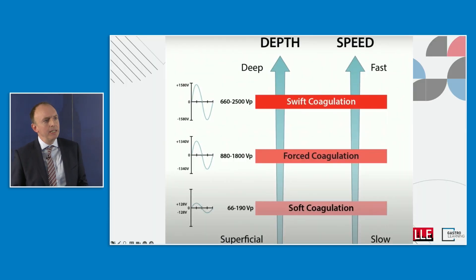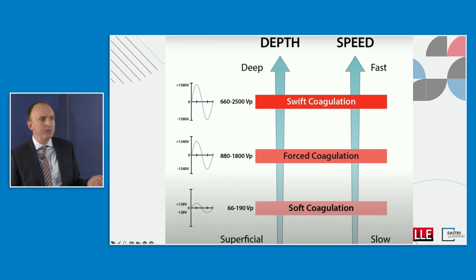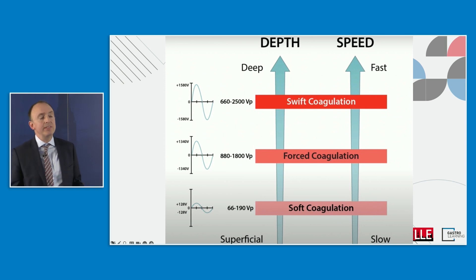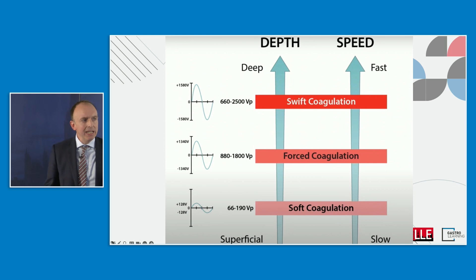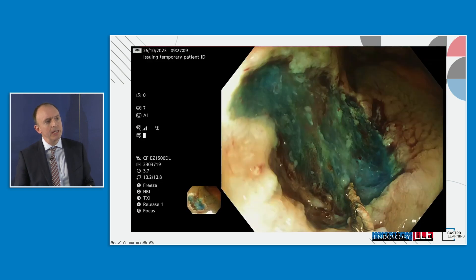Switching to the blue side of the screen — the coagulation options. You have three: soft coag, force coag, and swift coagulation. Swift coagulation can be ignored; the ERBe generator is not just designed for endoscopy and we don't use swift coagulation in endoscopy. Mostly when taking a polyp off it will be under forced coagulation, which is relatively high voltage with a lot of energy going in. Soft coag is lower voltage — a slower cooking of the tissue — making it much safer. It's used for haemostasis or to reduce the risk of recurrent adenoma.